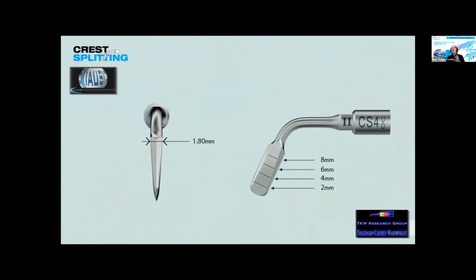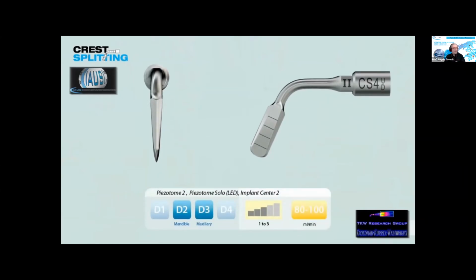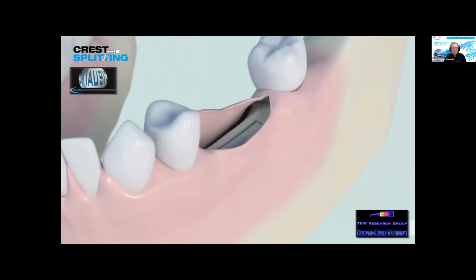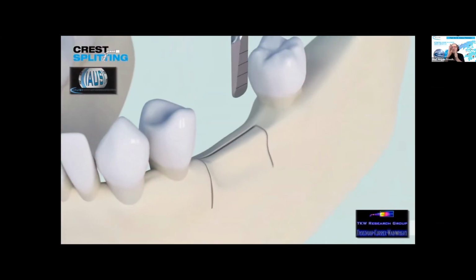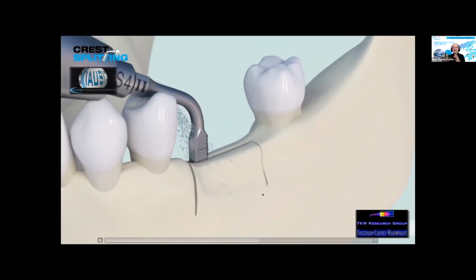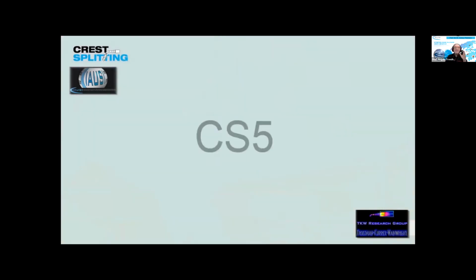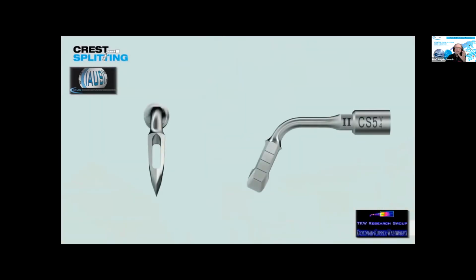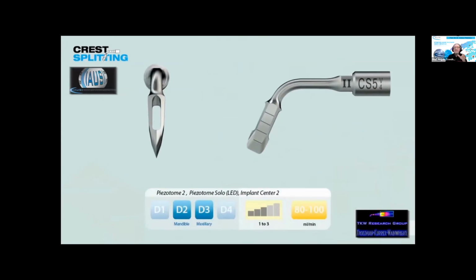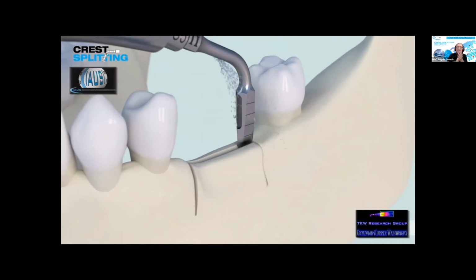And this is why I have to go down to 8 millimeters, because in another study, which we published in Surgical Device Development Journal, we found out that if you go only 6 millimeters, the fracture rate at the baseline here is much higher than with 8 millimeters, because it depends on the elasticity of the bone. And to further prevent any iatrogenic fracture by using chisels or whatsoever, we created these tips that slowly, step by step, are widening the bone. So the fracture risk with this method is almost zero.